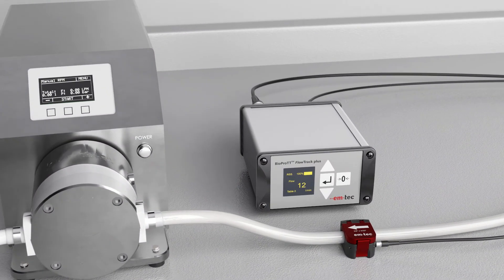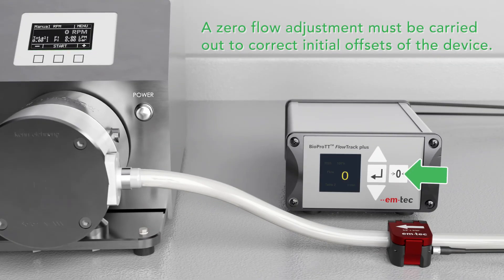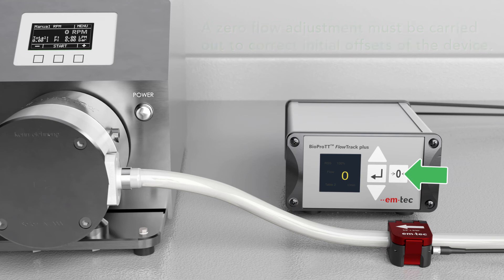Before starting each measurement, the zero flow adjustment must be carried out to correct initial offsets of the device. Ensure that the pump is turned off and the fluid inside the tube does not move.